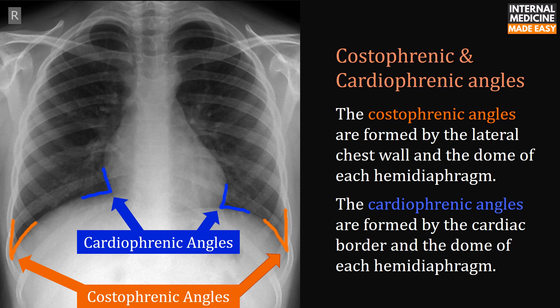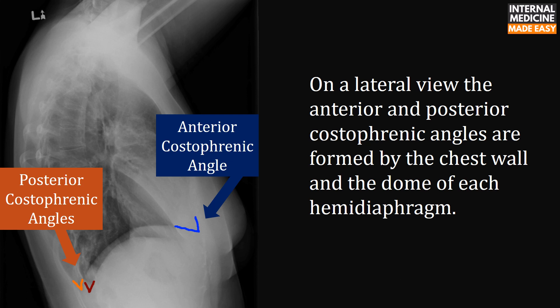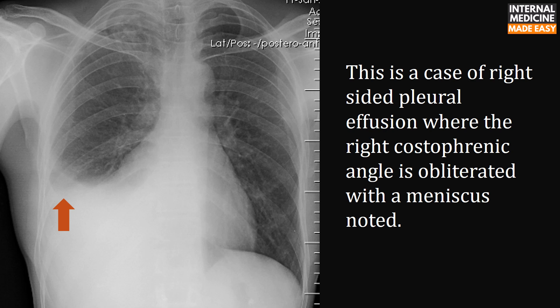The costophrenic angles are formed by the lateral chest wall and the dome of each hemidiaphragm. The cardiophrenic angles are formed by the cardiac border and the dome of each hemidiaphragm. On lateral view, the anterior and posterior costophrenic angles are formed by the chest wall and the dome of each hemidiaphragm. This is a case of right-sided pleural effusion where the right costophrenic angle is obliterated with a meniscus noted.